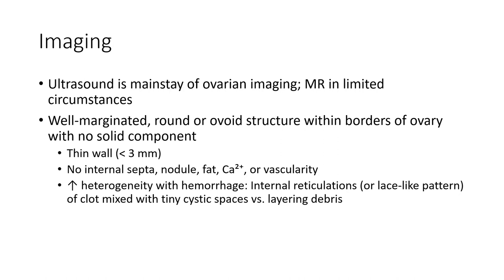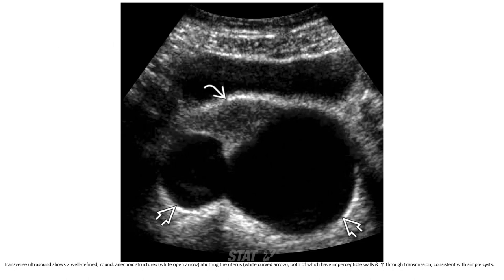Increased heterogeneity with hemorrhage. Internal reticulation or lace-like pattern. A clot mixed with the cystic space, which is a characteristic finding. Ultrasound shows two well-defined round anechoic structures adjacent to the uterus, both of which have imperceptible walls and increased through-transmission, consistent with simple cysts.